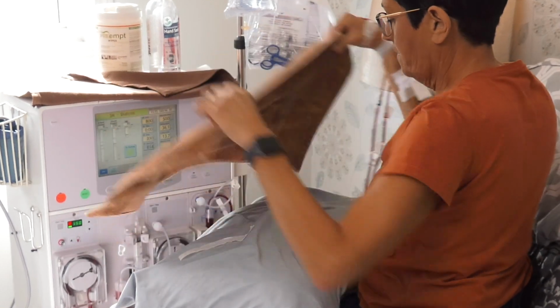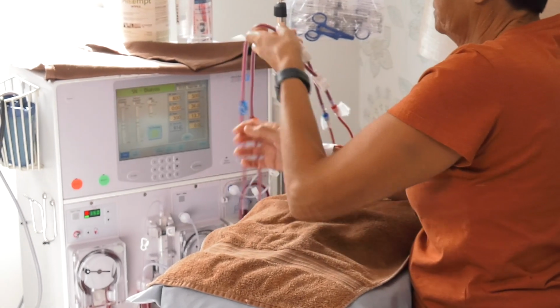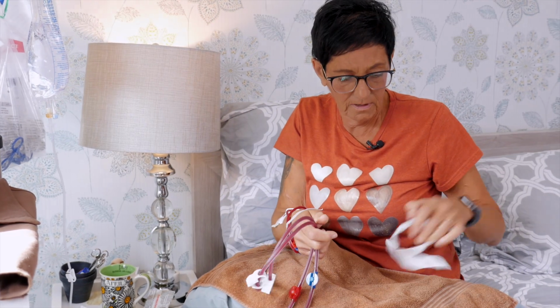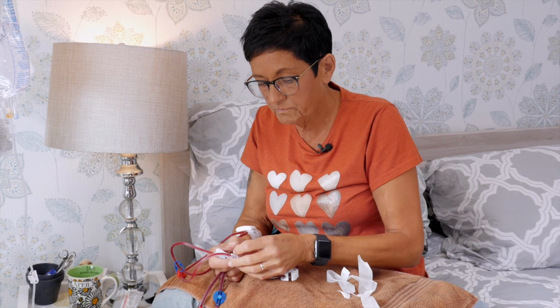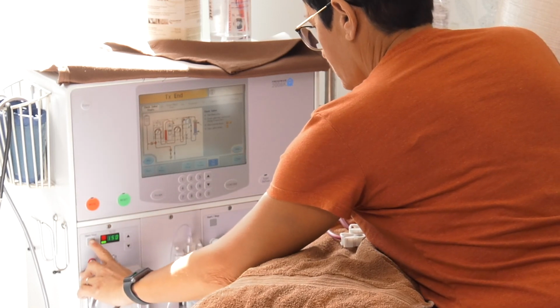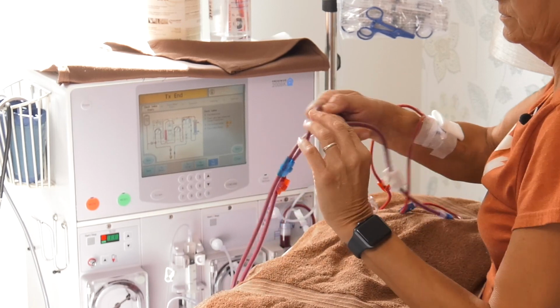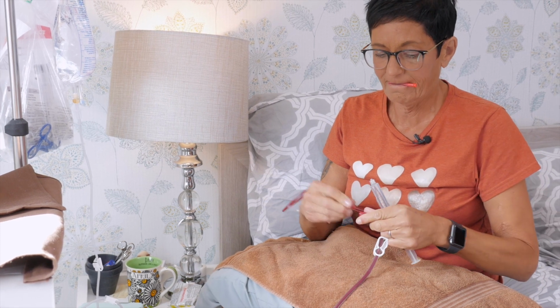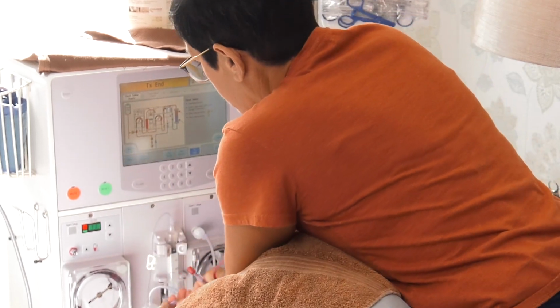Got my towel. Take all my tapes off. And then I'll hit treatment end, stop the blood pump. Undo it a little bit and then tie it back up. Hook my line up to my machine so I can return my blood.